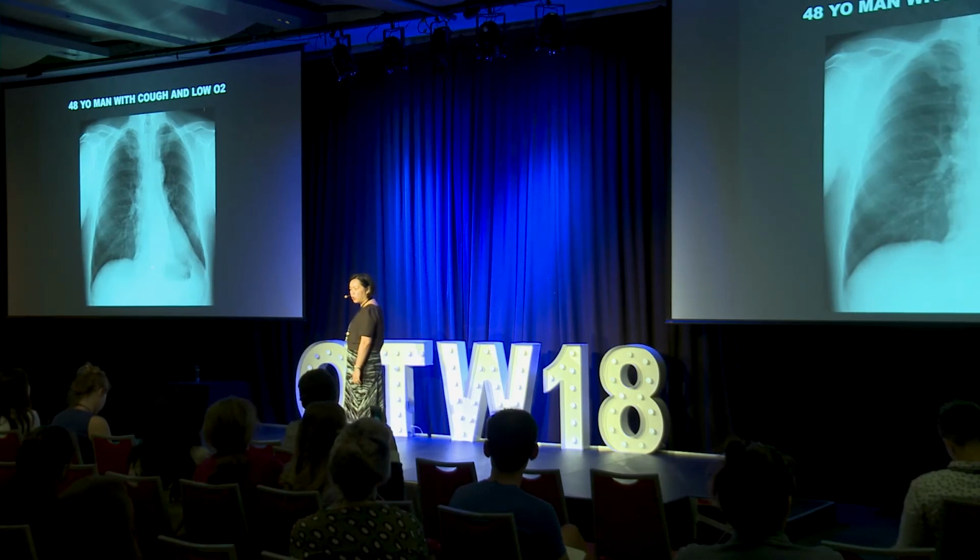So how can you confirm that what you're seeing is a real finding? Say you're sort of starting out, you're not really sure whether you're making it up. Yeah, get a lateral. A lateral will be very useful.